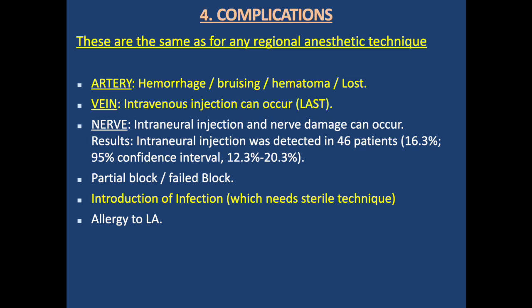There could be partial block or failed block like any other block. Introduction of infection needs sterile technique and taking care of this problem. Allergy to local anesthetic drugs could be a complication.